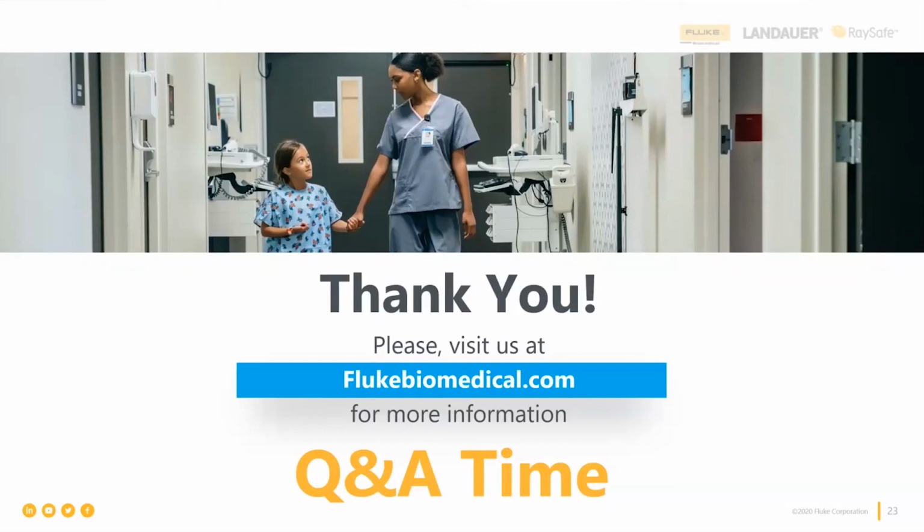I'm going to give you what Jerry would do. Jerry would say, I'm not going to trust them. I'm going to do periodic testing in a more thorough fashion, even if I have to buy extra batteries and pads in order to get that job done, because I want to be sure that every patient who needs that life-saving therapy gets it appropriately.